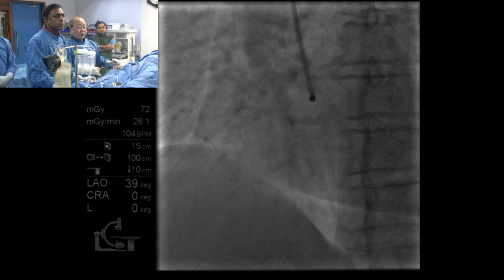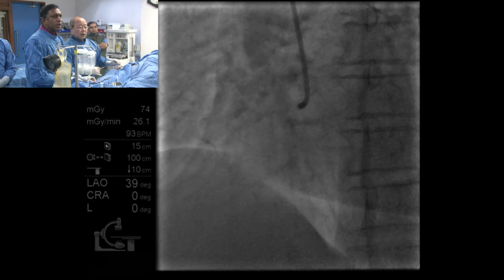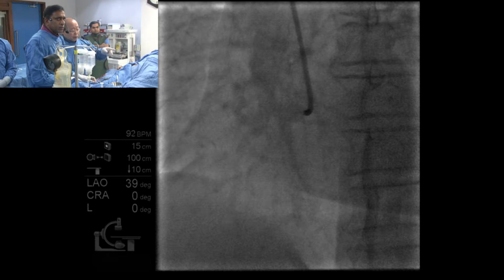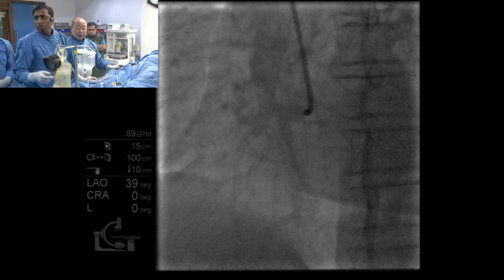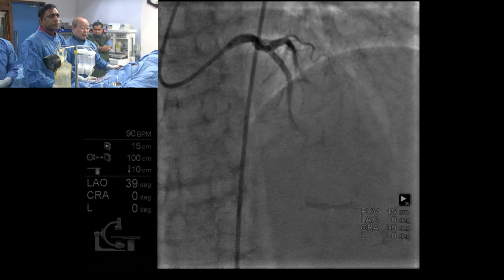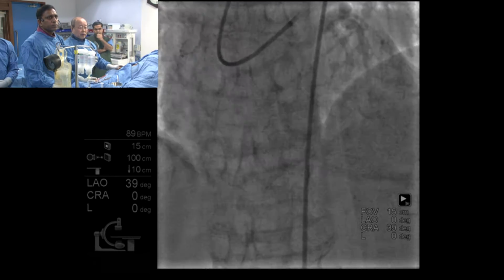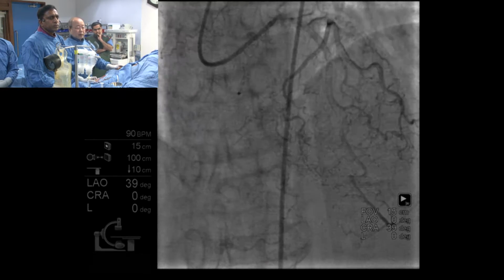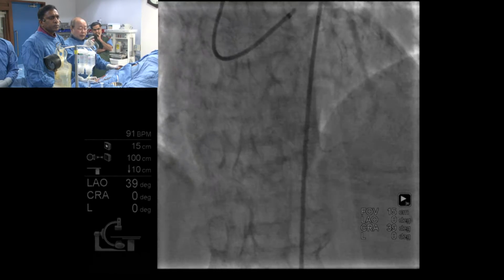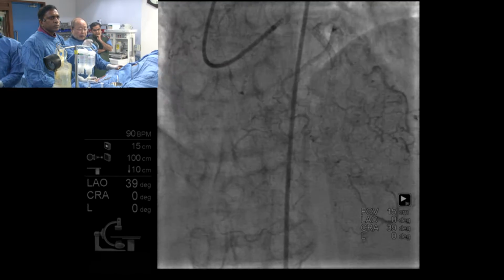Dr. Saito, are you planning antegrade or dual injections? Before doing this manipulation, we have taken the left coronary angiography, and it shows no restenosis, and still the collateral filling to the distal RCA is not good, and also the septal branch route is too tortuous.